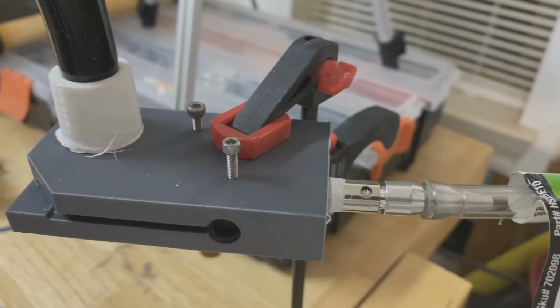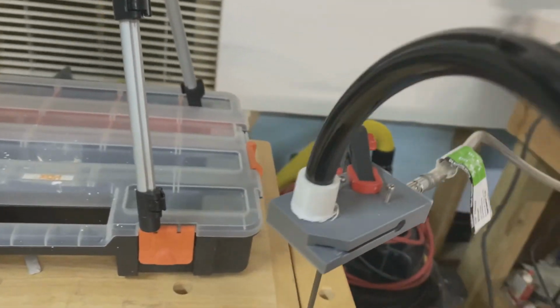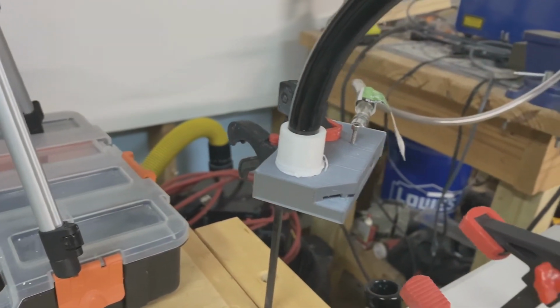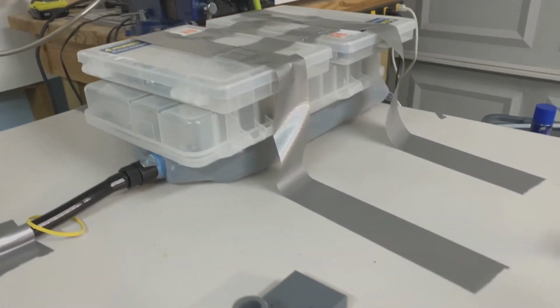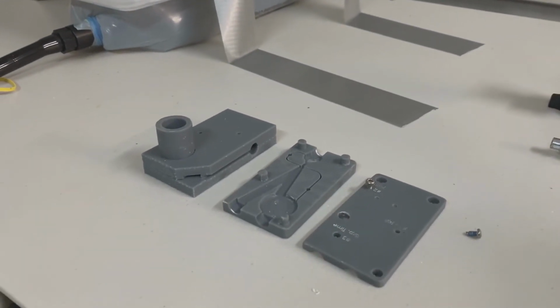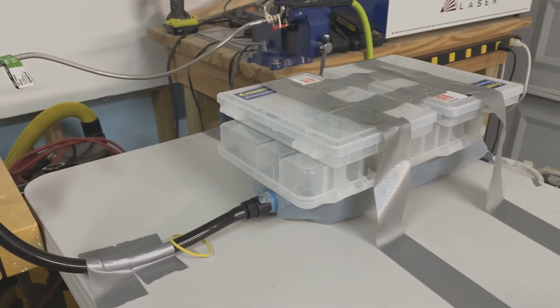And here's the device in action. The gray piece, no bigger than a deck of cards, is all that's really needed here. It's hooked to 2 tubes, one to a constantly flowing air source and one to a test lung with some weight on it. This is a single piece FDM 3D printed design pulled off by our teammate Artemio Mendoza.